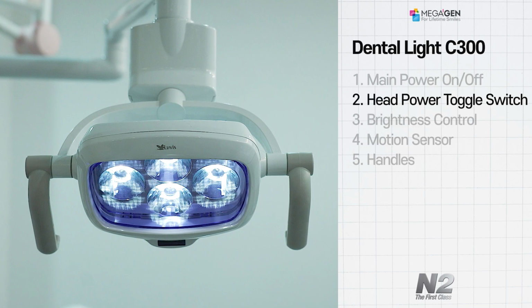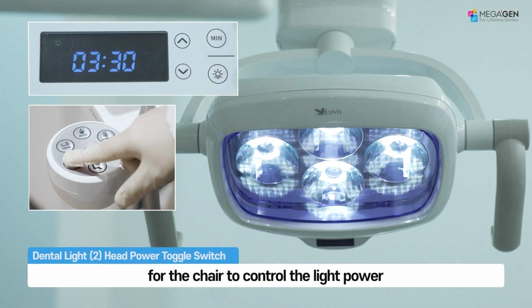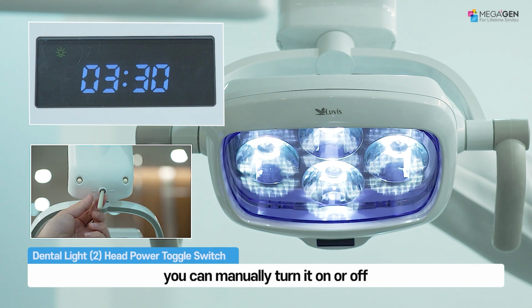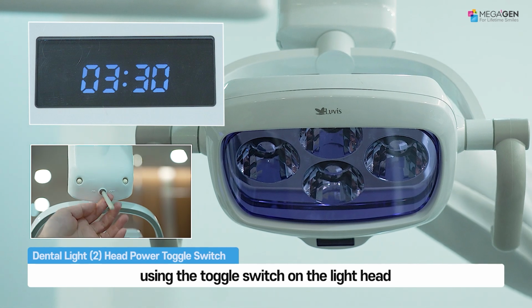Manually controlling the power from the light head. The toggle switch on the light head must be set to on for the chair to control the light power. Conversely, if the light is already on via the chair, you can manually turn it on or off using the toggle switch on the light head.